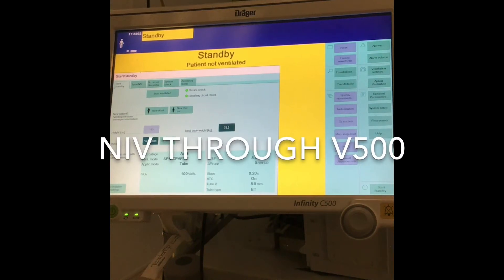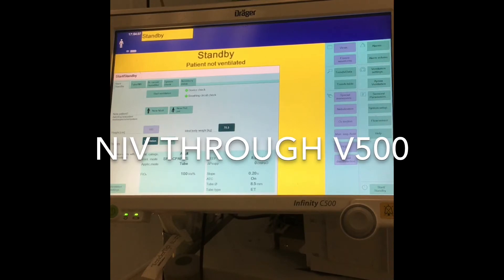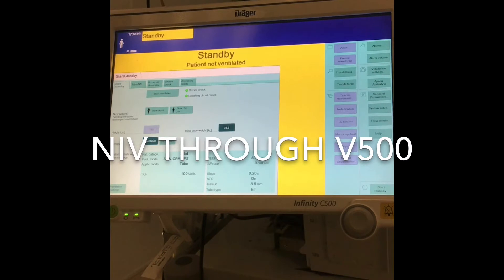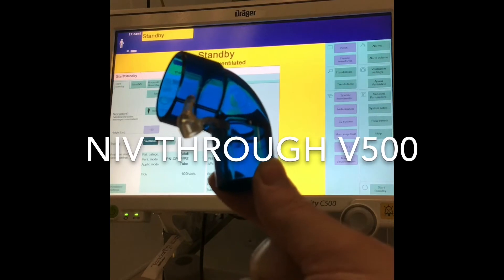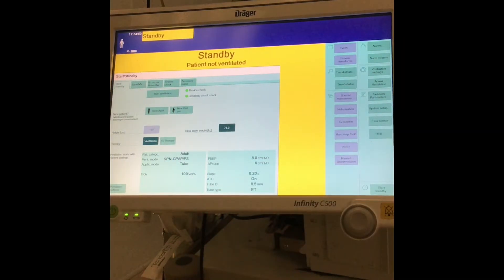NIV through the ventilator can be done on either a full face mask or a half face mask. The connection just needs to be changed to one of these blue connectors, which can be found in the respiratory cupboard in one of the top drawers. By the connectors, I mean this part here.